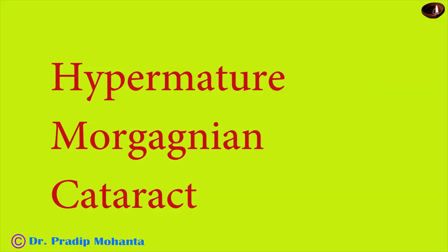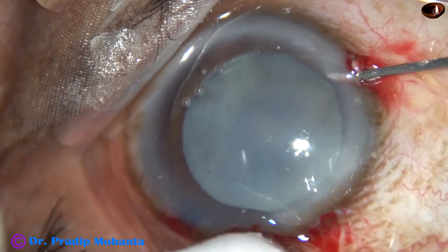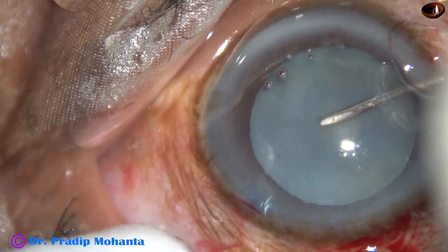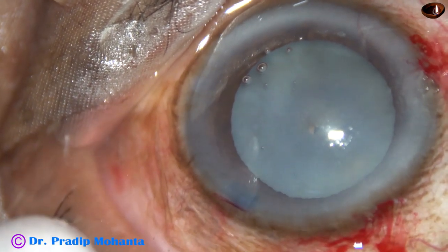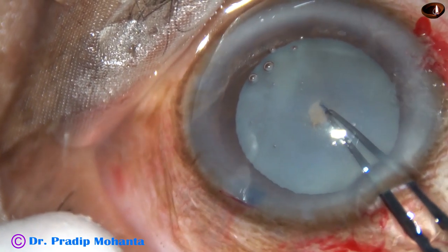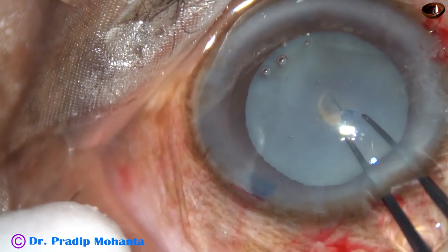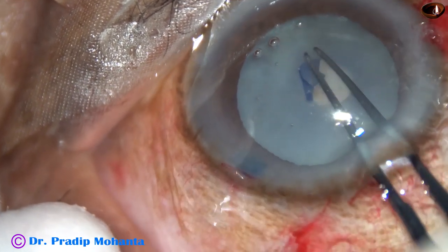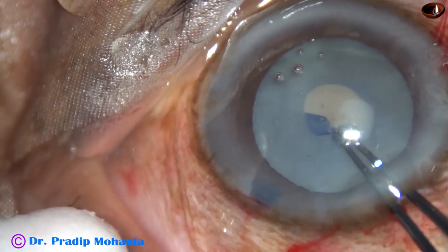Now this is a hypermature Morgagnian cataract. The anterior capsule has been stained with trypan blue dye. A 26-gauge needle cystitome has been used to make a puncture on the anterior capsule, and now as I try to do a small rhexis, milky fluid comes out.